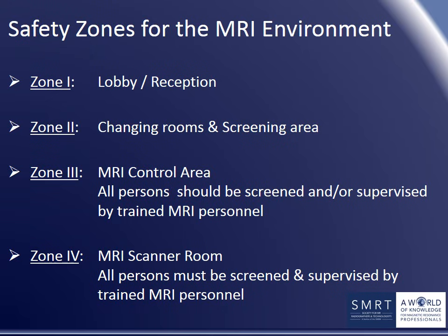Thank you, Claire. MRI departments are similarly designed to restrict access to the strong static magnetic field. This is to prevent untrained, unscreened personnel or members of the public from inadvertently entering the MRI scanner room and coming into contact with the strong static magnetic field. There are a number of guidelines around the world for restricting access in MRI departments, but all these guidelines have the same objective, which is to ensure safety in the MRI environment at all times.